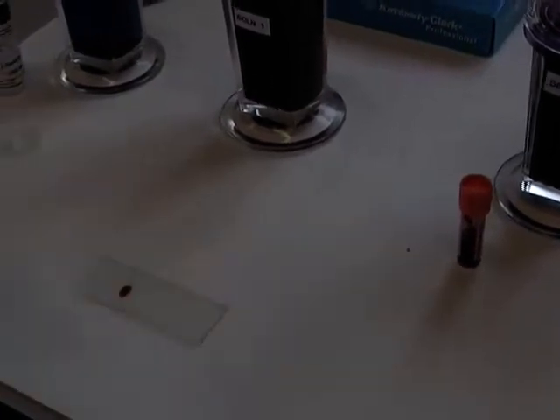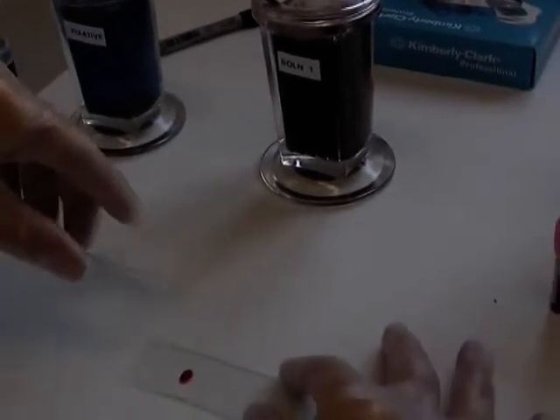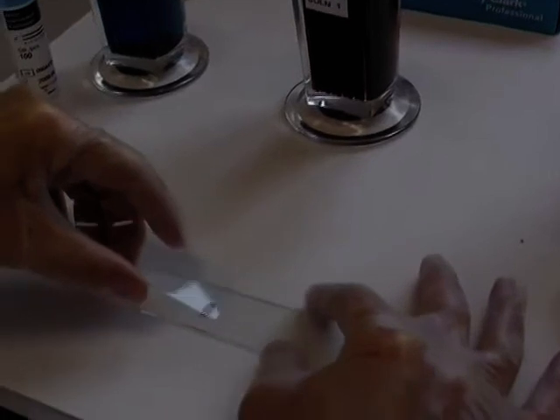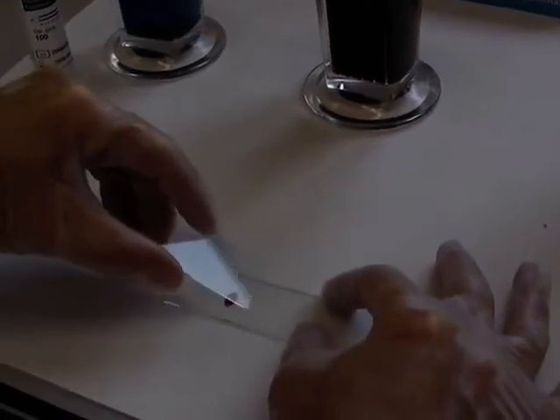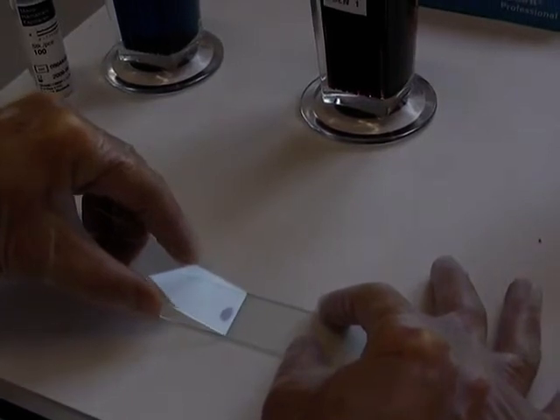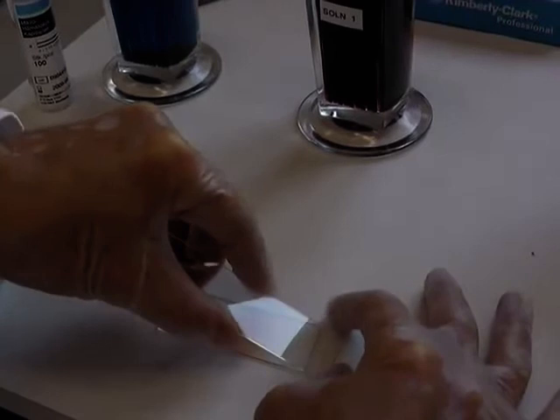And now to make your smear. Hold another glass slide between finger and thumb at about a 45 degree angle. Hold the first slide, draw back onto your blood sample — you can see the capillary action — and then draw forward quickly.